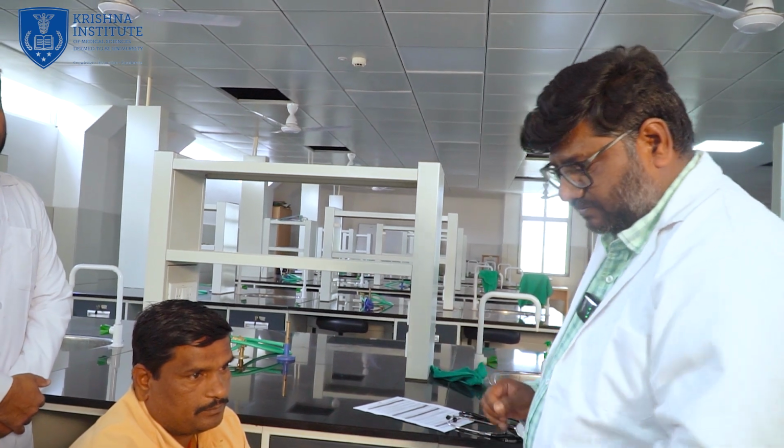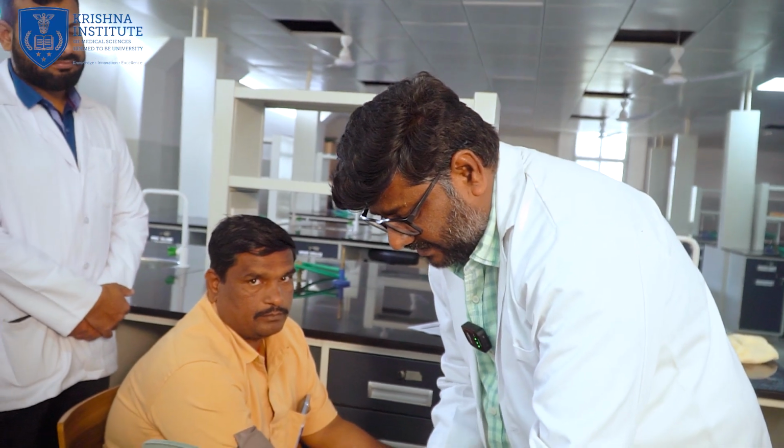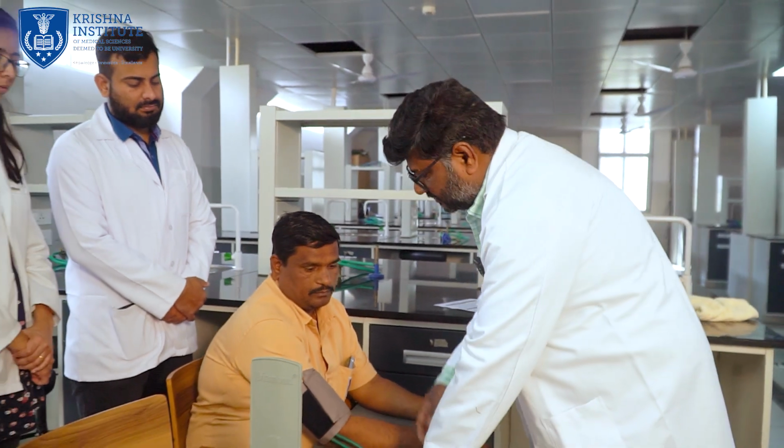You should document the blood pressure and you can tell the patient that the examination is complete. You are supposed to thank the patient.